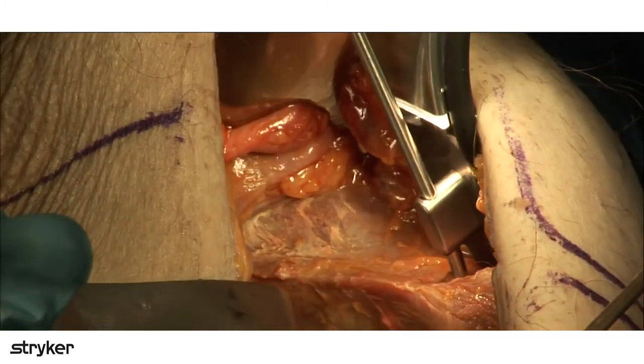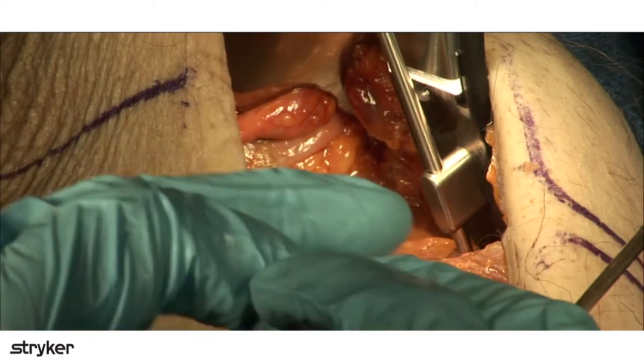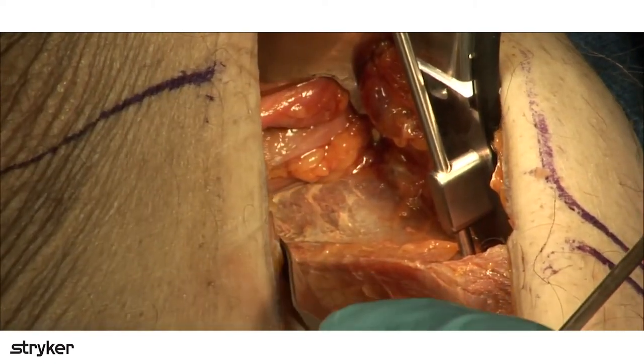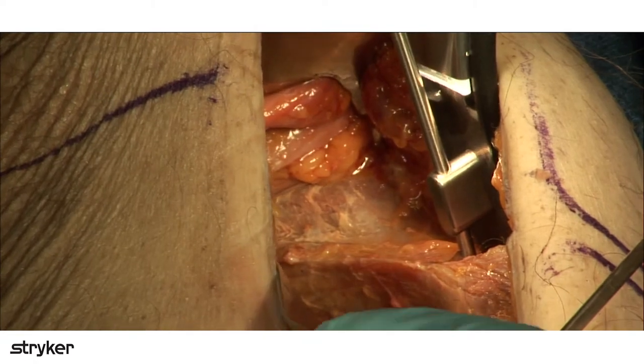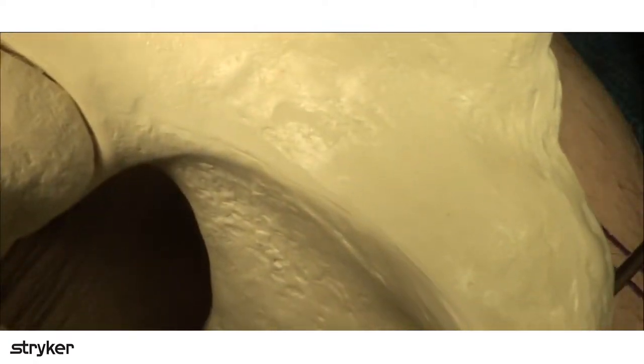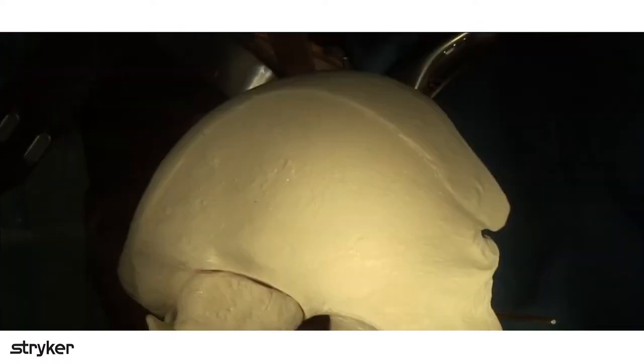And you're going to see here that you're going to come. Do we have a pelvic model, actually? Can I see that pelvic model? So let me see if I can come in here. Can you zoom out for just a little bit on that?